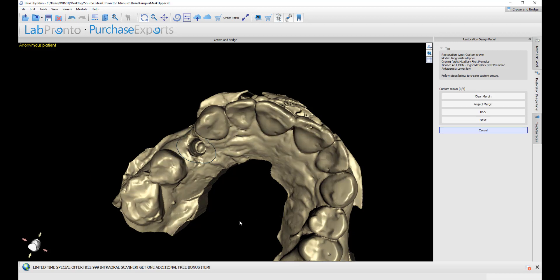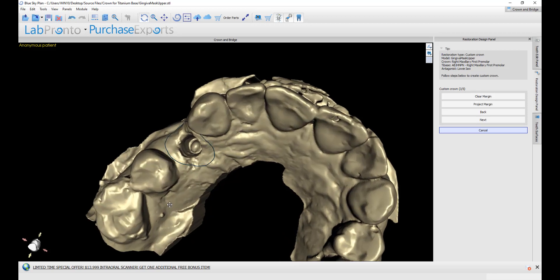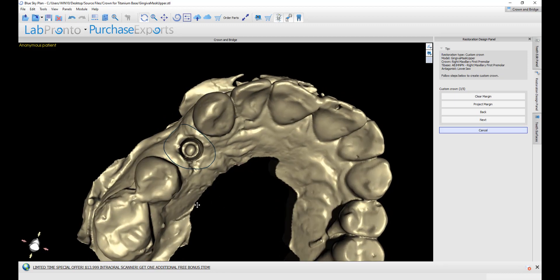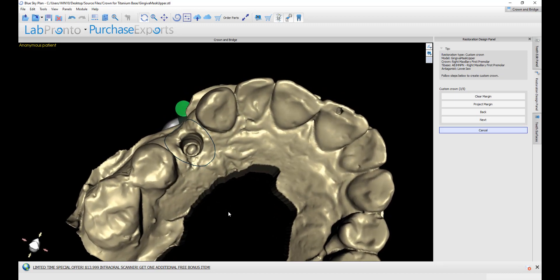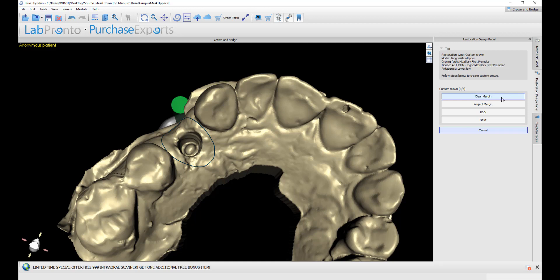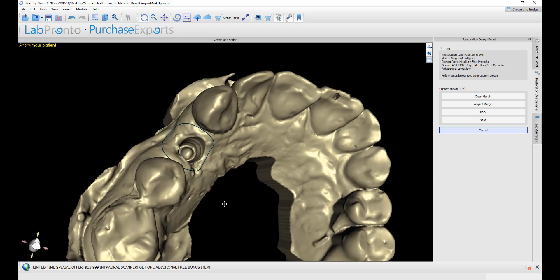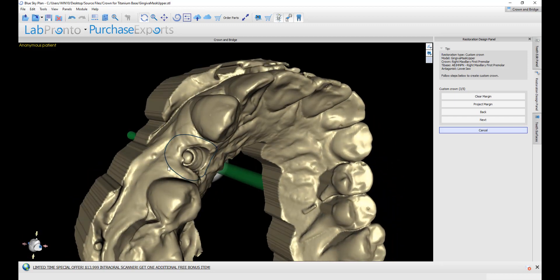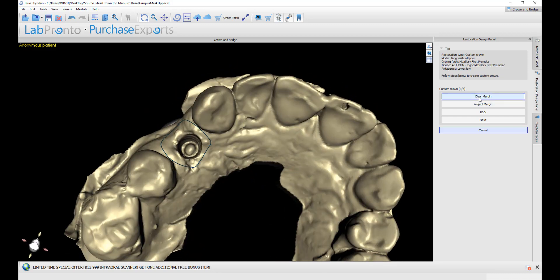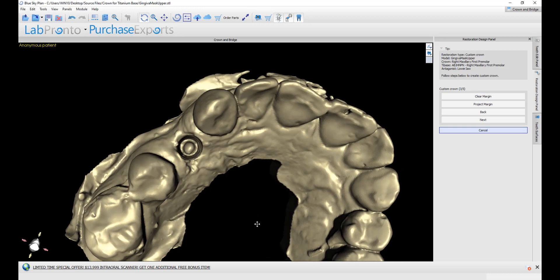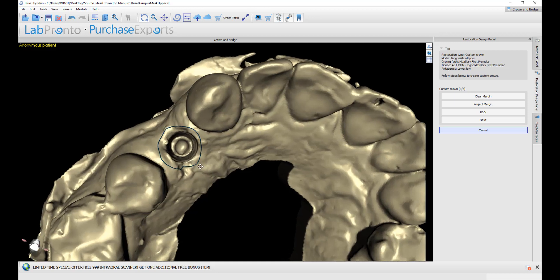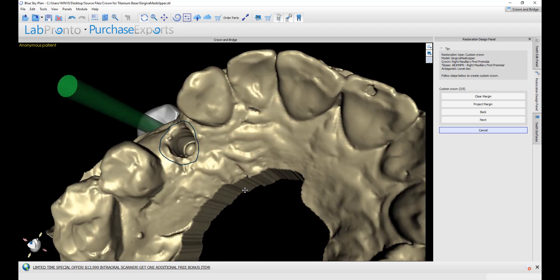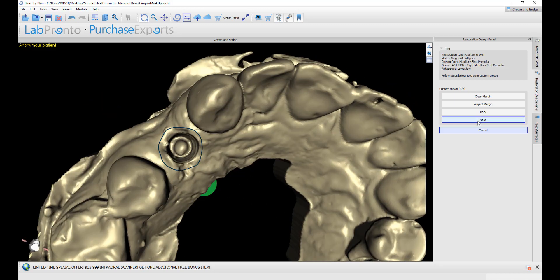The software draws the margin curve proposal automatically. We could fine tune it by clicking clear margin and just drawing it ourself. Or just hold down the shift key and left drag to redraw the curve. Or if we click clear margin, then we could hold down the shift key and just start placing dots with our left mouse button around the curve. And at the last point, just drag it to reconnect to the start point. Once we have the desired curve, click next.